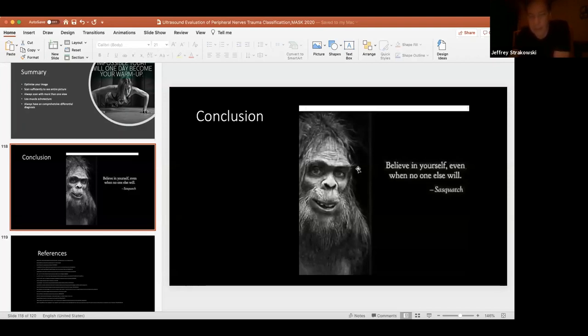So I think you can study in that population: do a vascular study to look at the lumen of the radial artery and look if there are any aberrant branches, look at their muscle architecture, and look at the exit point of the superficial radial sensory nerve when it becomes volar and subcutaneous, and how mobile is it? Is it something that can be just rolled out of the way, or is it relatively fixed? Some people, those sit really close to each other, and some people it tends to not be as close to the artery at all. And if that's a consistent problem, you could scan them in advance and try to figure that out too. I hope that answered your question.